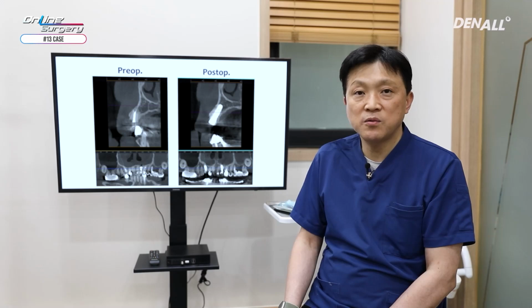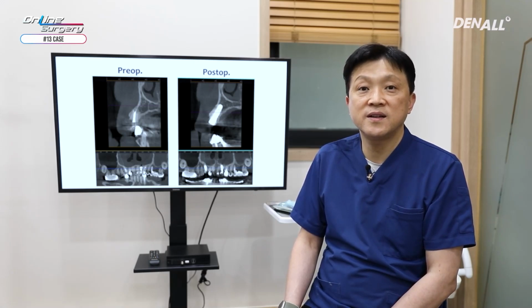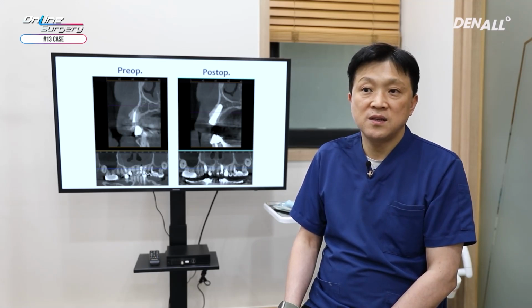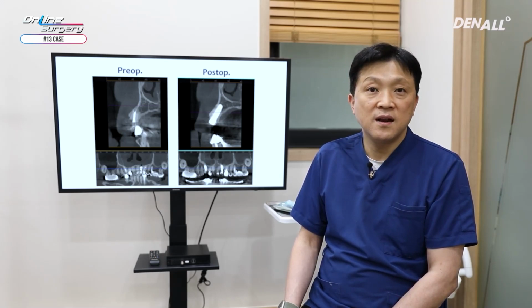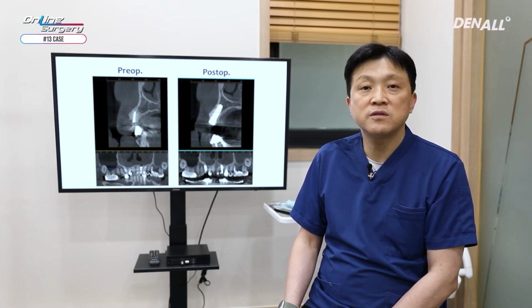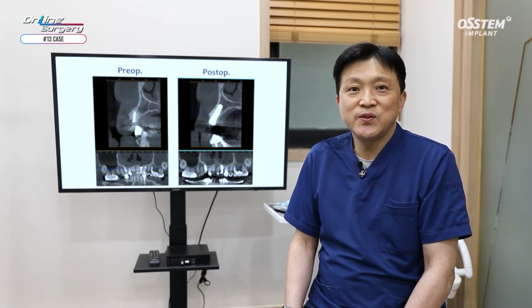In that case, if you place implant freehand, unintended errors can occur. Therefore, by using one guide or other guides, you can get better results. Rather than opening flap when there's no dehiscence defect or fenestration defect, as shown, without opening flap, you can utilize dual zone graft concept. I think this could be a great choice. This is the end of my surgery.